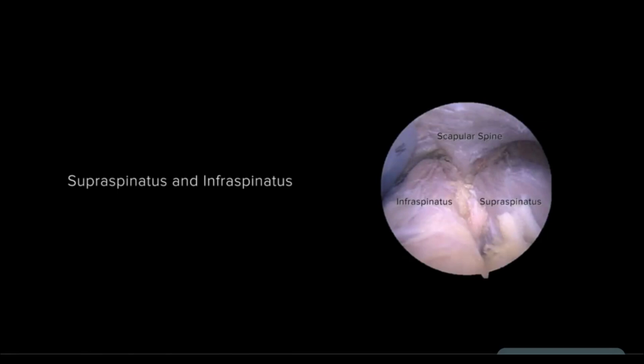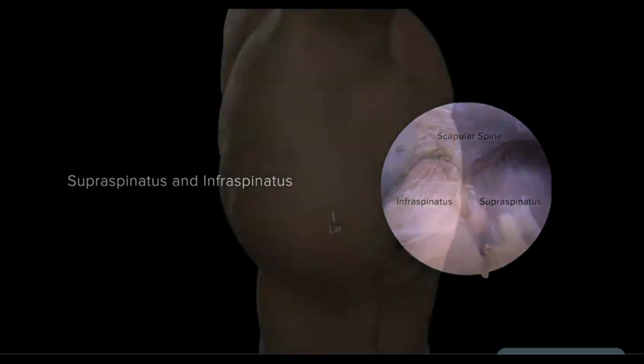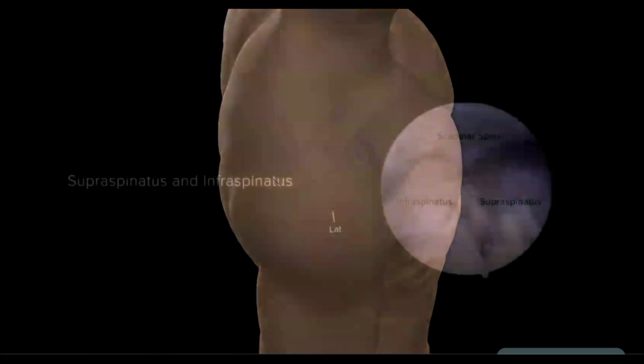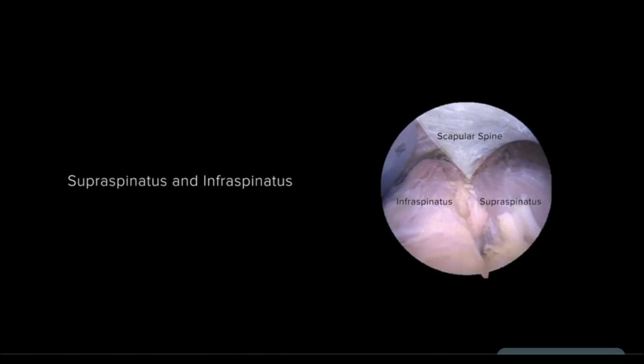This arthroscopic image is in the subacromial space of a right shoulder, viewing from a lateral portal. This image provides a clear view of the scapular spine, located centrally and separating the supraspinatus muscle anteriorly and the infraspinatus muscle posteriorly.